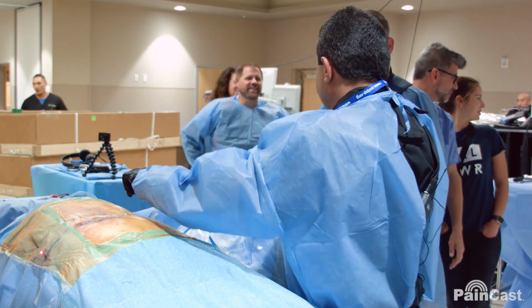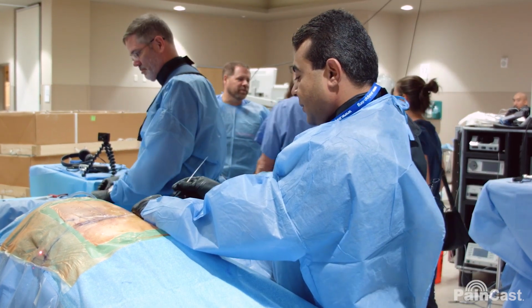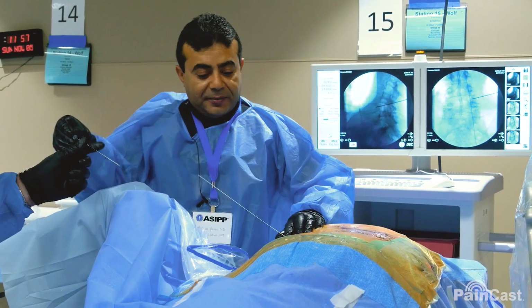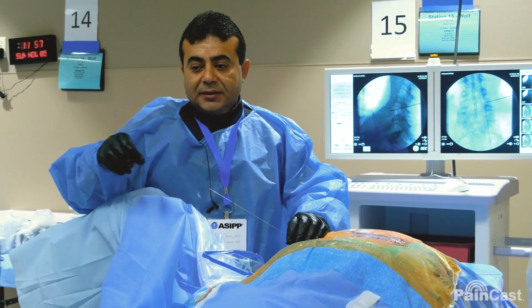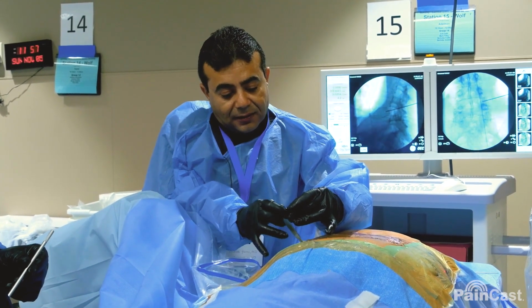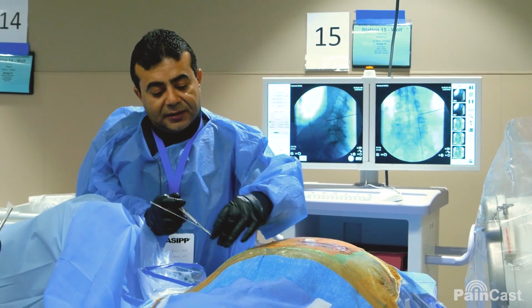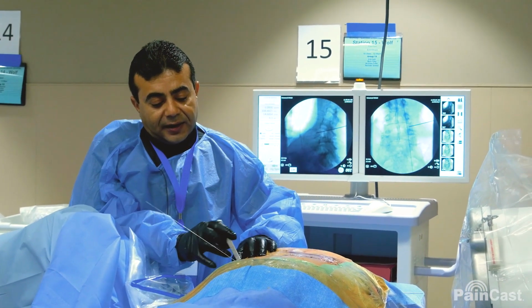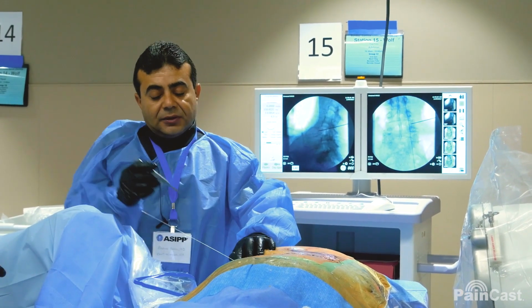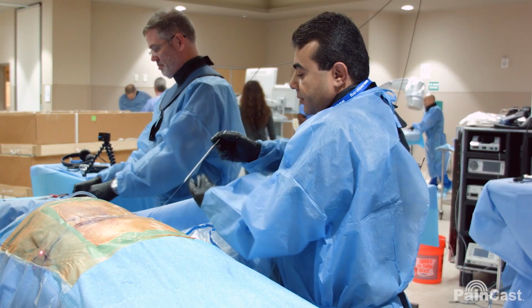Then we put the guide wire. Needle out. And we make a cut in the skin. Make sure you really have a good cut in the skin because you don't want your dilator to just catch the skin. Good, nice cut. Put a dilator in.